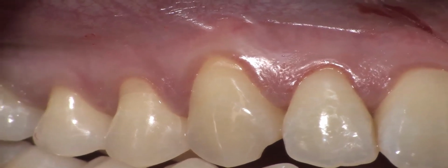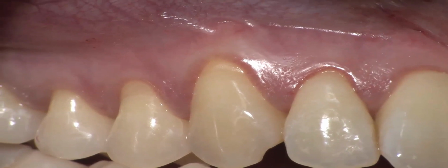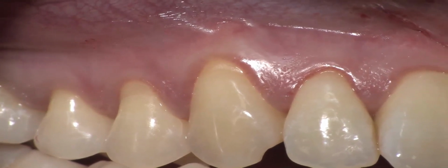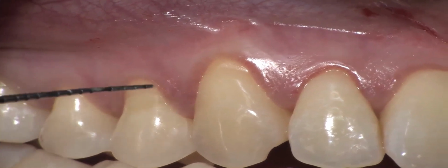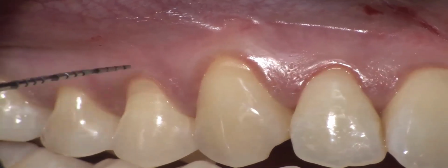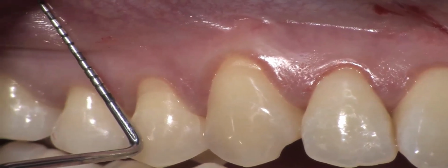The Beaver. Of the other incision, in order to make the flap absolutely the same in the area of the oblique incision and in the area of the vertical releasing incision.